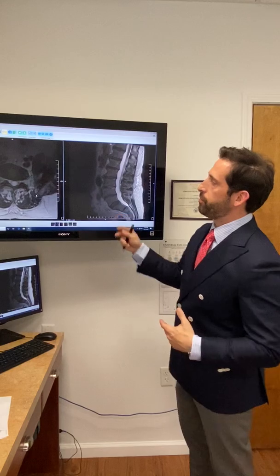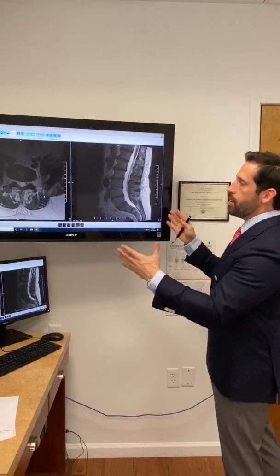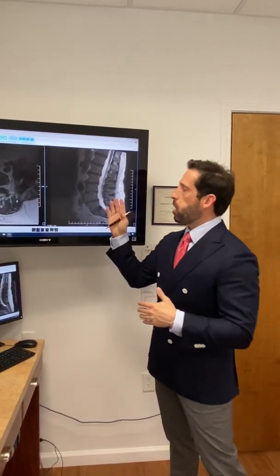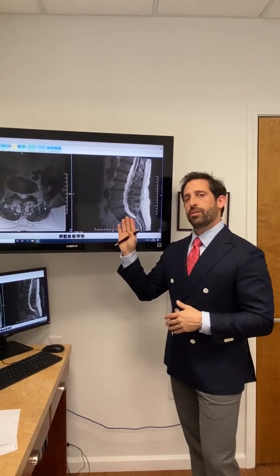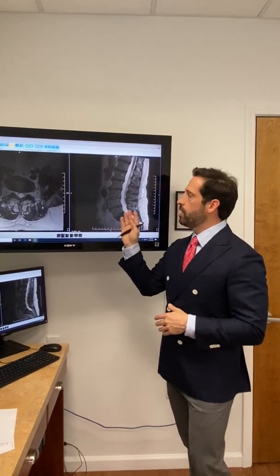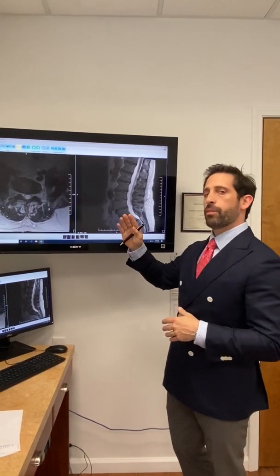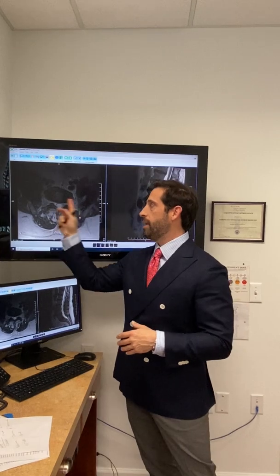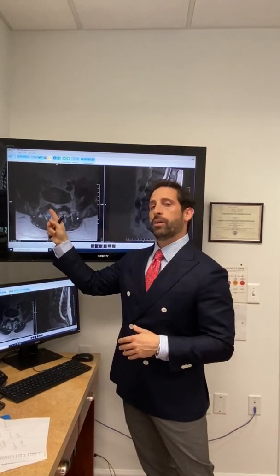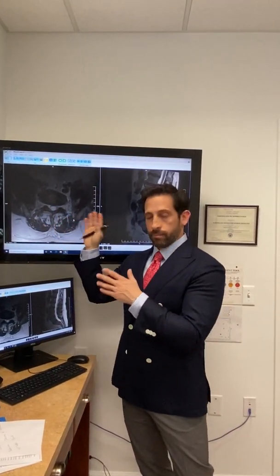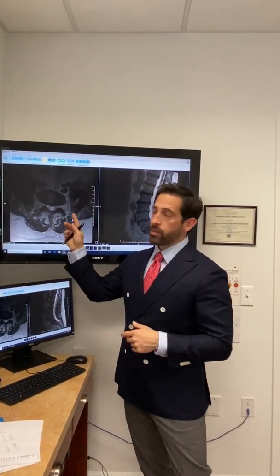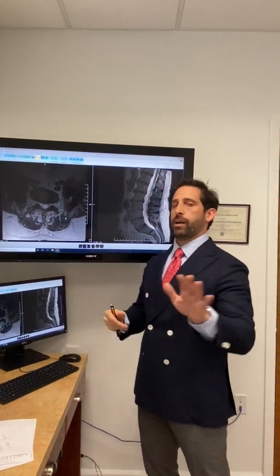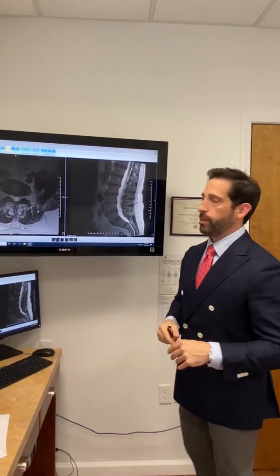Here you have two images of the same part of this person's body. On the image on the right, this is known as a sagittal image, or from the side. On your left, you're looking at an axial image of someone's lumbar spine — low back — but this time we're looking from the feet up.